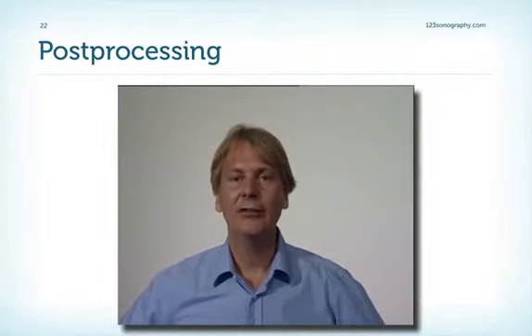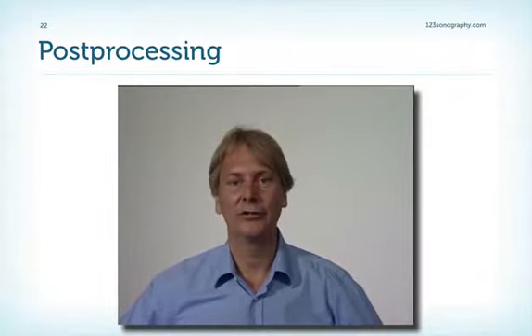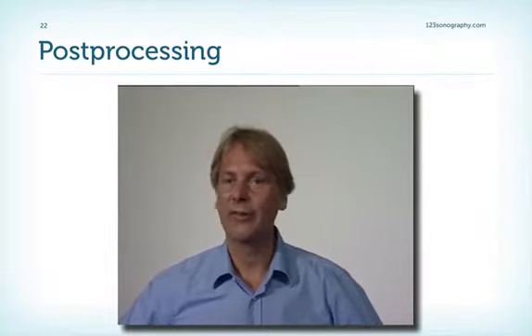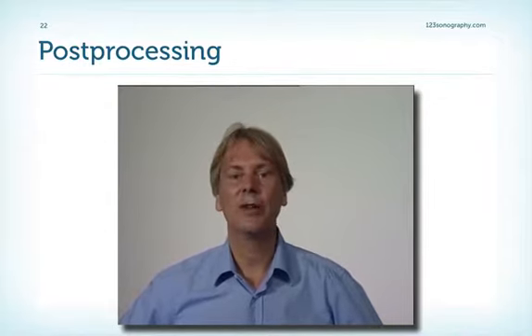Imagine you're on vacation and you take a photo which is very important to you. But unfortunately, the lighting situation is not very good. What do you do? Well, you take this photo to your computer and you play around with it with special software, with image processing software, and then you end up with a photo which looks much better than the original photo. Basically, this is exactly what post-processing is. It's taking the information we have and trying to change it and manipulate it in such a way that it appears better for the eye. In echocardiography, the object is to enhance our ability to interpret structures and to make a diagnosis.